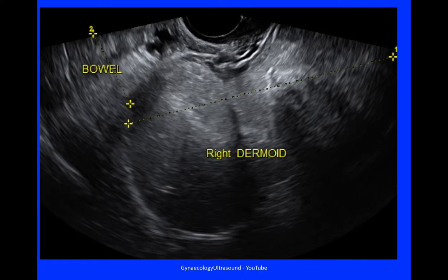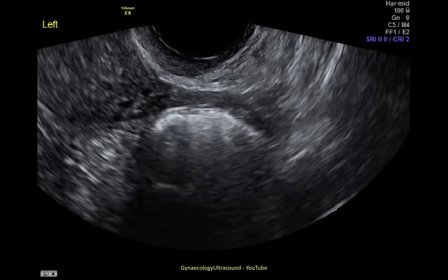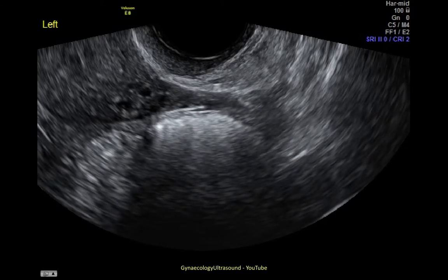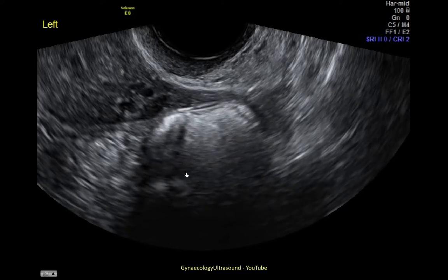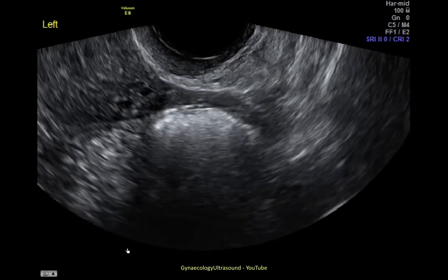A dermoid can mimic bowel. This was a 140mm dermoid — it was unilocular with mixed echogenicity and minor vascularity. You can see that there's bowel next to it; this is the dermoid and here is some bowel, and the echogenicity is very similar. The difference is that you can often see peristalsis in the bowel. In this case, the patient had normal ovaries but some bowel in the adnexal area. On closer inspection, there was active peristalsis, so this was not a dermoid.